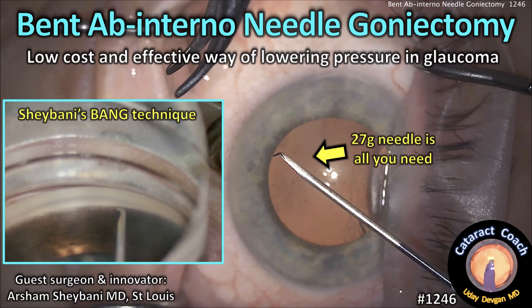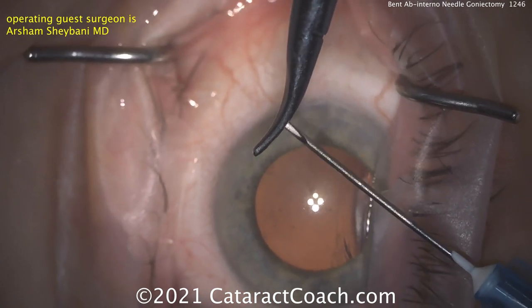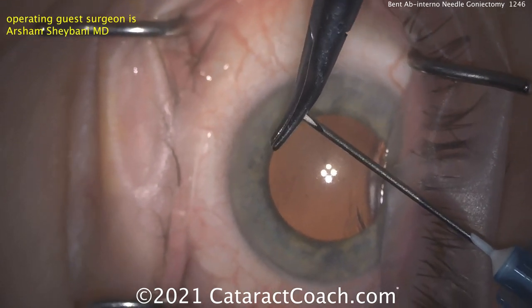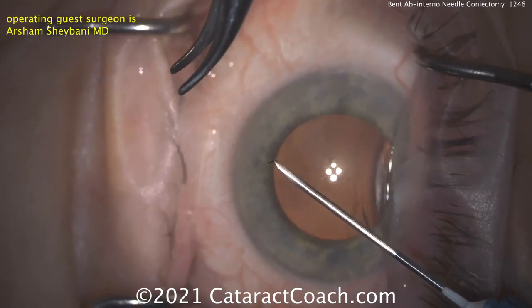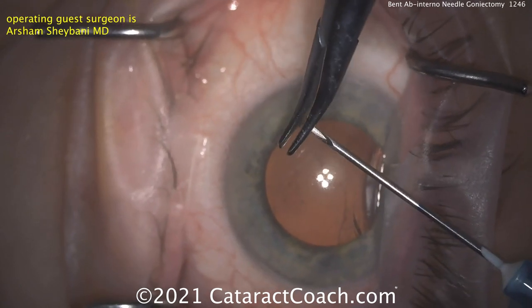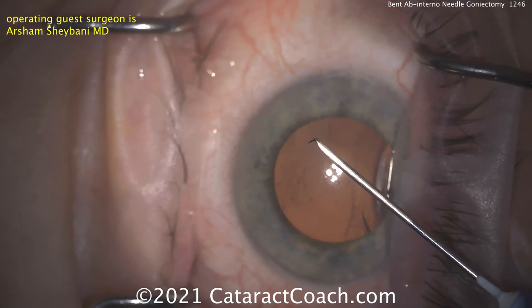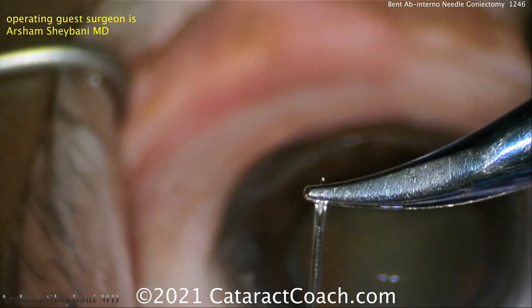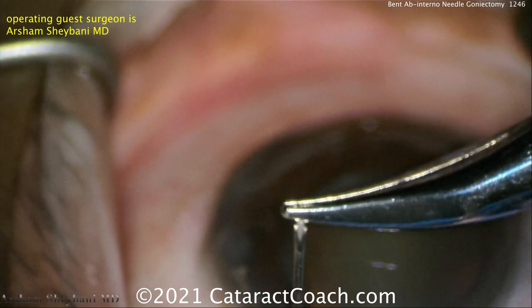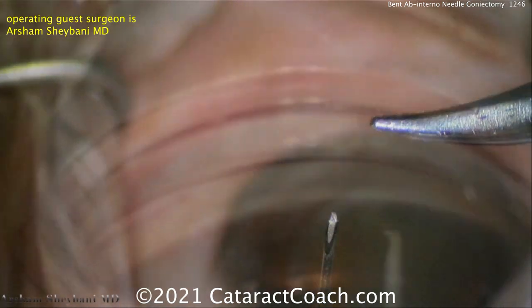cataractcoach.com: Bent ab interno needle goniectomy — the BANG procedure. This is a low-cost and effective way of lowering intraocular pressure in glaucoma. Using a 25 or 27 gauge needle, bend the tip a little bit less than 90 degrees — so about 75 to 80 degrees. You can also put a tiny extra bend at the very tip to make it easier to access. Make sure it's five-eighths of an inch long, not the half inch.